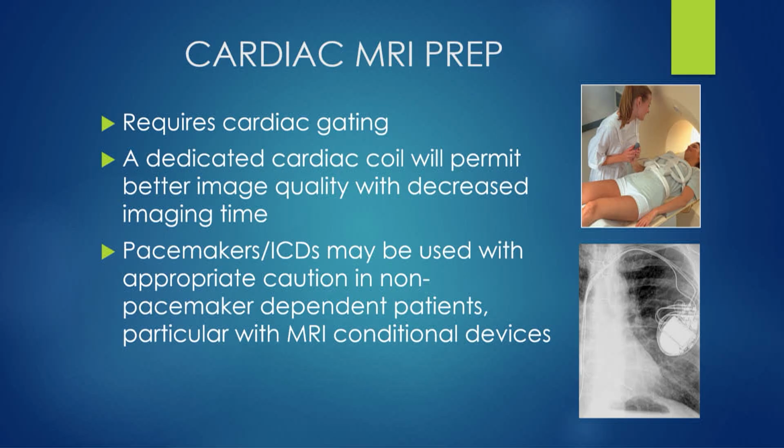To go as far as saying that you can't do cardiac MRI or any MRI for that matter in the setting of one of these devices is no longer really true. You have to find out if they're conditional, and depending on what the situation is, have them monitored. Valves, for the most part, are fine.